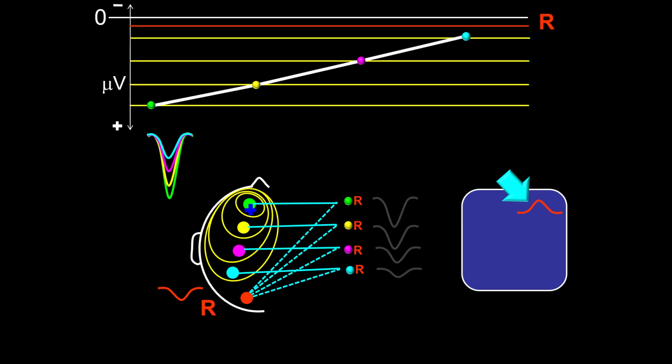As you know, the wave will be inverted. Next, I take the green wave and place it in the box, but with the same direction as it was presented by the side of the isopotential map. I have not changed the polarity of the wave because it is entering through input 1. Thus, its polarity is not inverted.